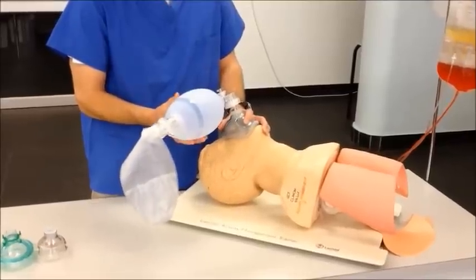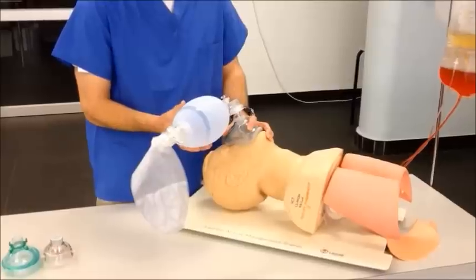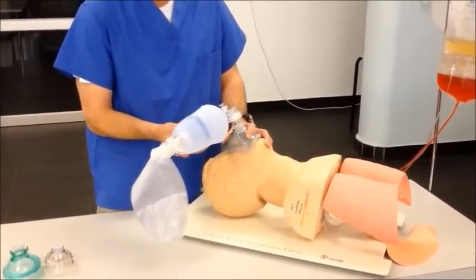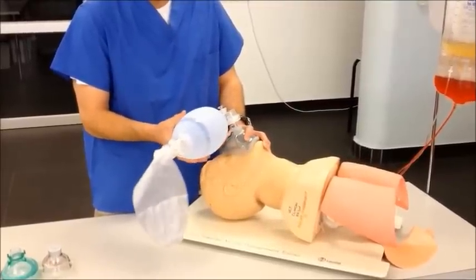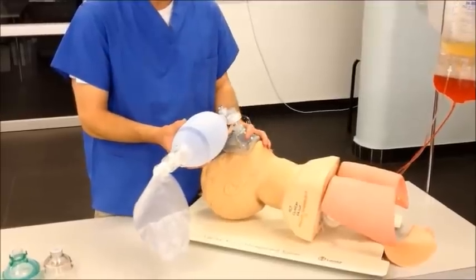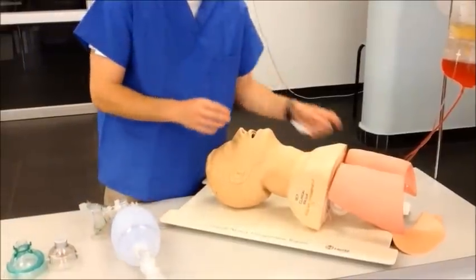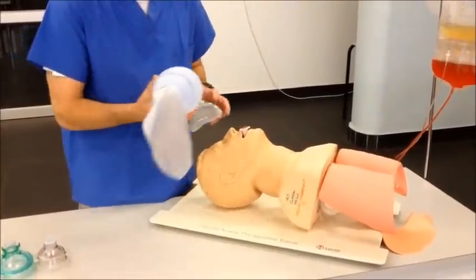Most adult patients should be ventilated about ten times per minute, or one breath approximately every six to eight seconds. Make sure that your inhalation phase is faster than your exhalation phase, but not so fast as to cause injury. If the patient's mask is well sealed and the airway is correctly positioned but movement of air remains a problem, consider inserting an upper airway adjunct device to facilitate your ventilation.